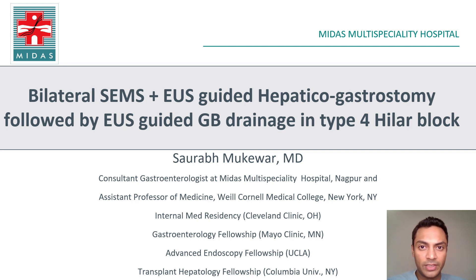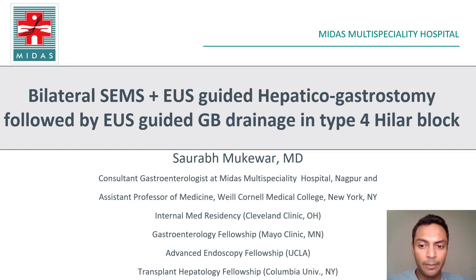Bilateral self-expanding middle stent, plus EUS-guided hepatico-gastrostomy, followed by EUS-guided gallbladder drainage in a patient with type IV hilar block.